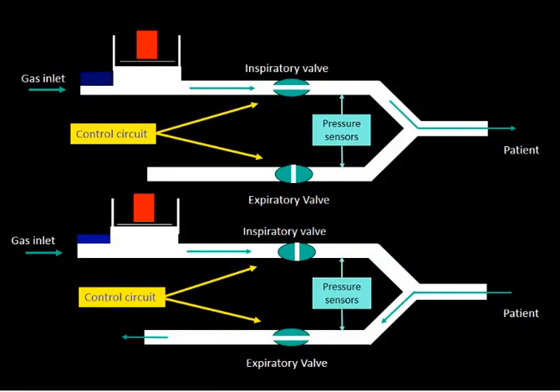So, in essence, I think it is important to understand what the ventilator is and how the ventilator works to understand the principles of mechanical ventilation. In essence, the ventilator is a system that delivers a flow. Whatever setting we apply on the ventilator, whatever number we change, the only physical entity on which the ventilator can act, and this is in the name itself, is the flow.